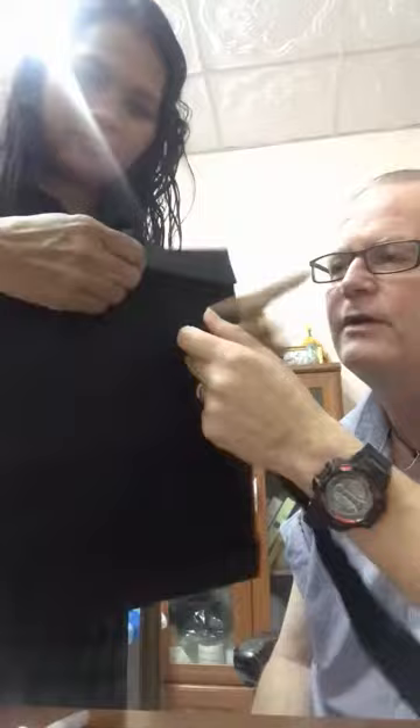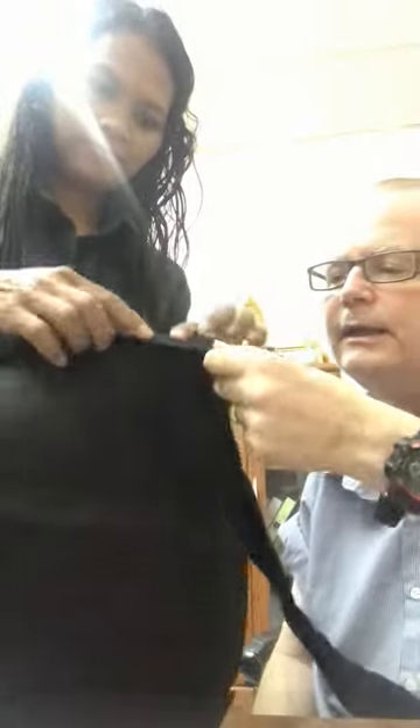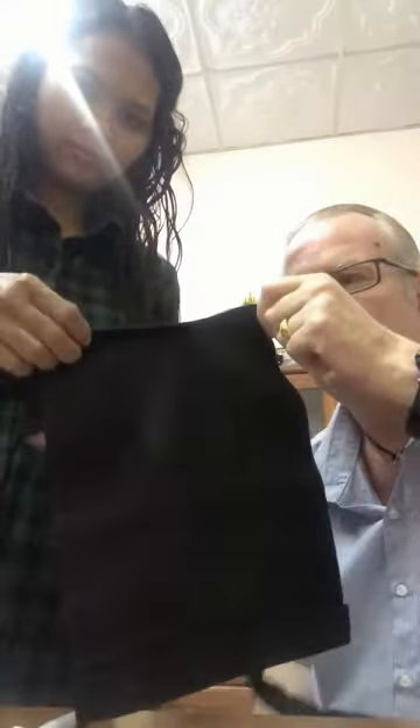Before we show you the catheter bag, I'd like to show you the back and the hook and loop fixings that we have. Basically, if you look here, there's plenty of material for you to get your hands on so you can pull up the top cover. That's where you will install the catheter bag.